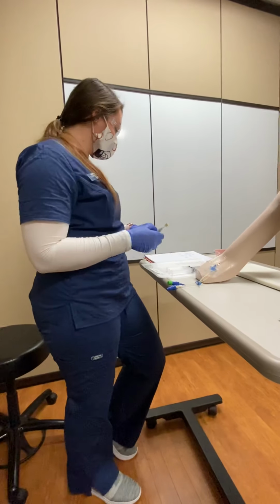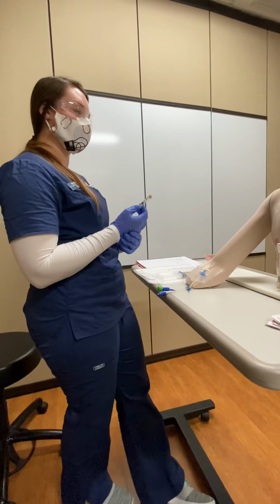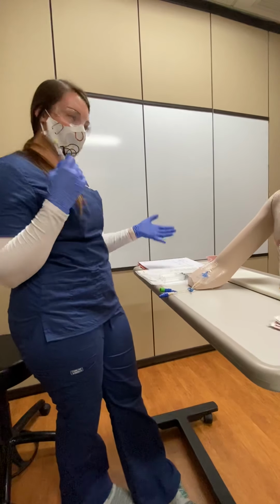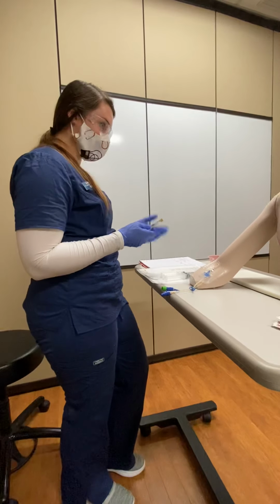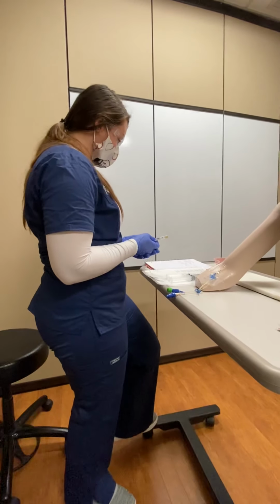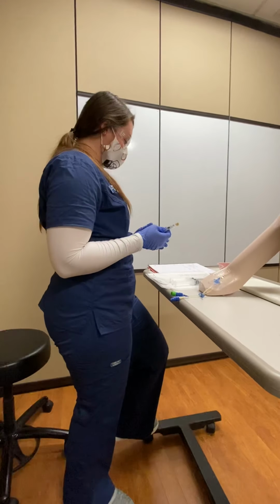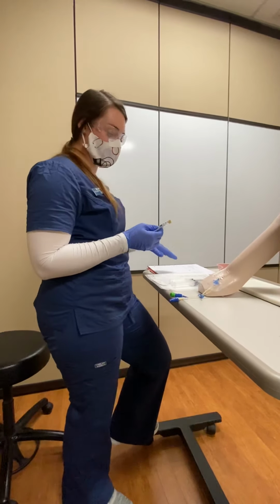There are some side effects that we need to be watching for, which would be dizziness and arrhythmias. So if you feel dizzy, you need to let me know. And then I looked up in the drug book that this needs to be given over 2 to 5 minutes, so I will be doing that when administering.